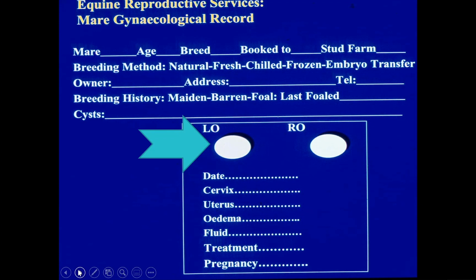But that's actually incorrect. I think it's very, very important for us as veterinarians working in the field of mare gynecology to get used to recording the presence, or otherwise, you may not be able to see it, but making some comment about the corpus luteum.